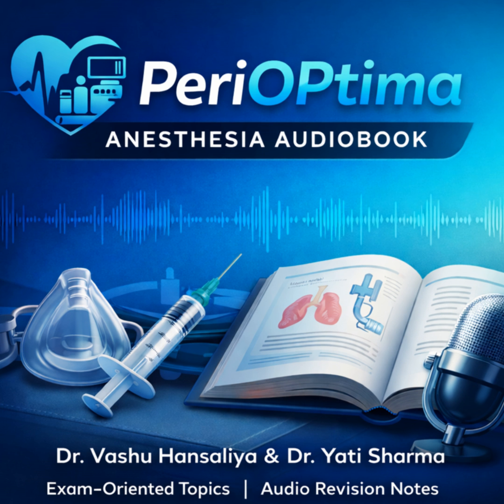What are the non-negotiable steps for preparation? Preparation is everything. First, size selection. It has to be accurate. You need to know the standard size ranges, size 1 for neonates up to size 6 for the largest adults, over 100 kilograms, because the chosen size determines both the seal and the final position. Okay. Second, meticulous lubrication is mandatory. Use a water-soluble lubricant and apply it only to the posterior surface of the mask. You don't want to block the aperture.